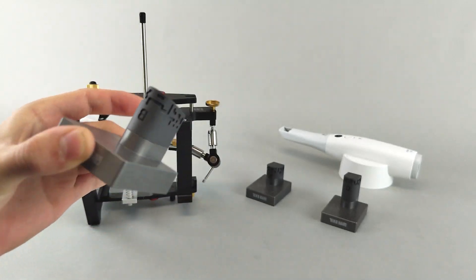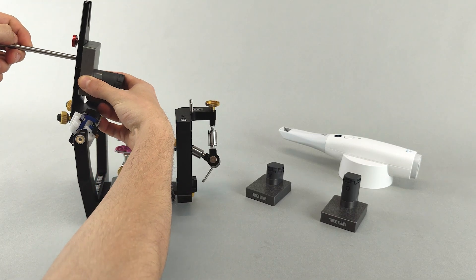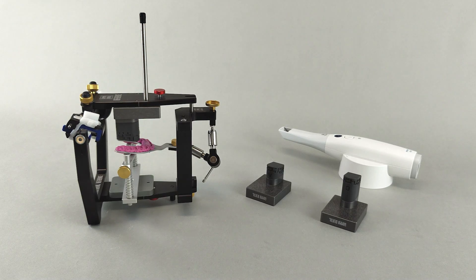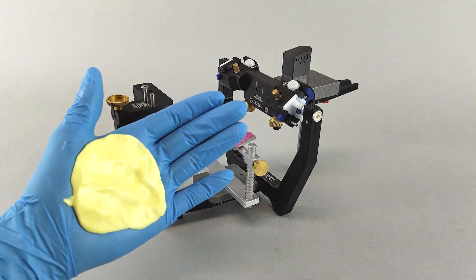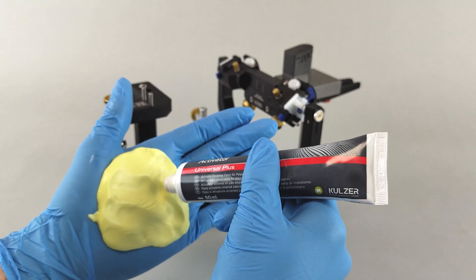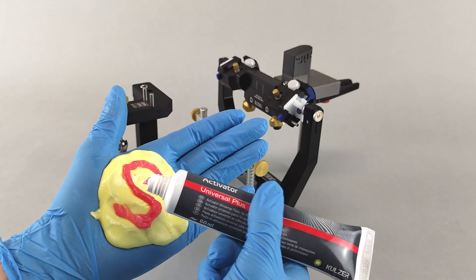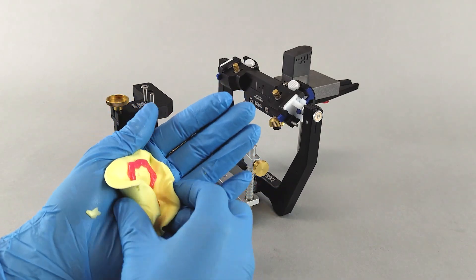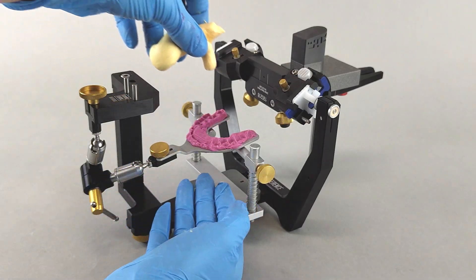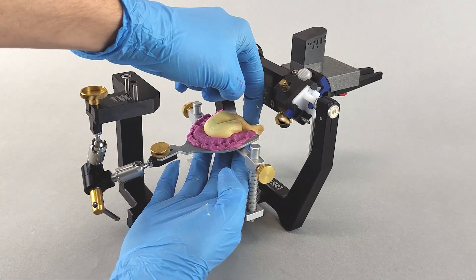As the measurement area of typical intraoral scanners is relatively small, a large gap between the bite fork and the transfer block may result in the scanner failing to connect the two surfaces into one continuous scan. It is therefore recommended to fill this gap with soft and malleable bite registration material. First, open the transfer stand or articulator, use an adequate roughly palm-sized amount of putty material, add the activator, and knead the material thoroughly to mix the components.